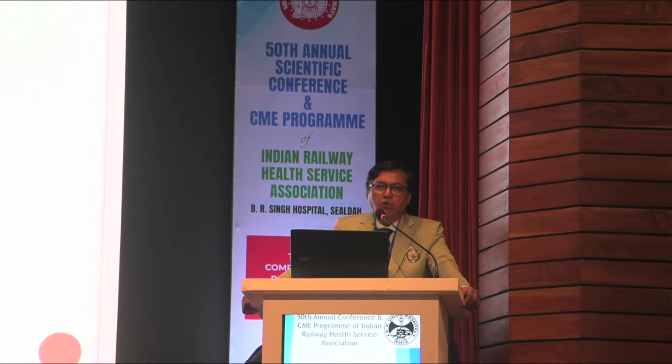But nowadays, most of the medical colleges are equipped with top of the line laparoscopic sets, and all the professors and associate professors who have come up were trained in laparoscopic surgery. So the PGTs, the house surgeons, are also being exposed to laparoscopic surgery. Longer operative time in some cases depends upon the person who is doing it, and upon the type of case that we are doing. The risk of trocar injury and carbon dioxide complications is gradually decreasing as we are getting more trained, as we are getting more accustomed to this sort of surgeries.